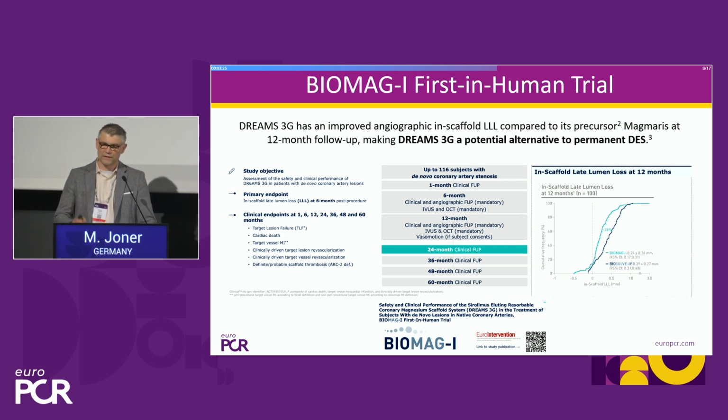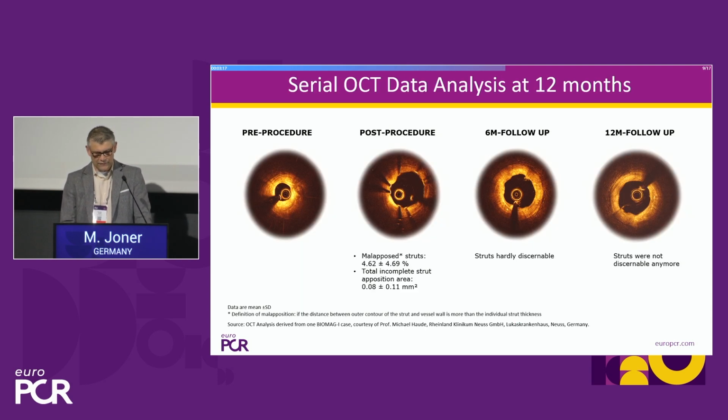So it's a left-shifted curve in terms of late loss. So also that was clearly improved, and there will be follow-up up to 5 years in the study also. I have shown this already.